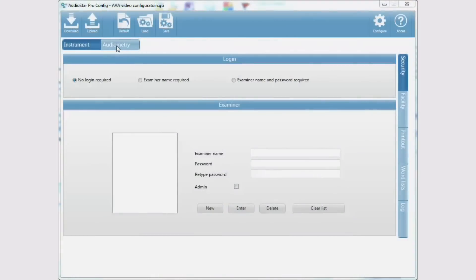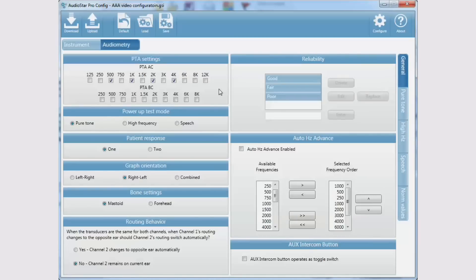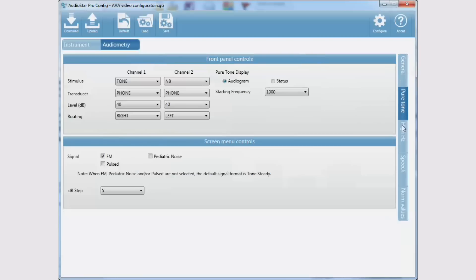Settings such as audiogram orientation, startup test mode, routing behavior, default transducers, and starting intensity can be designated in the configuration software and downloaded to the AudioStar Pro.